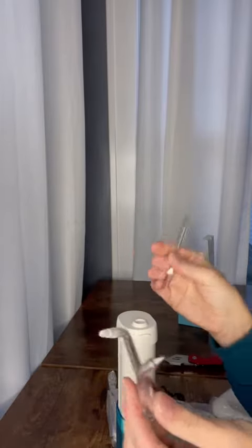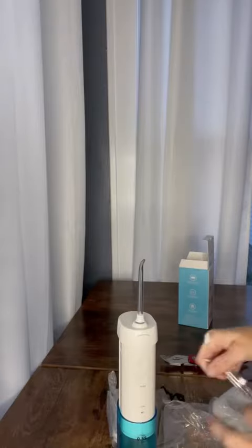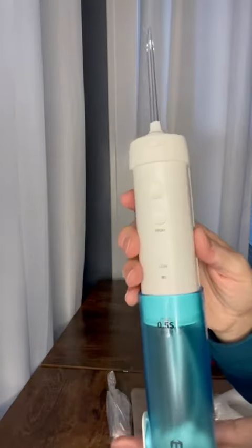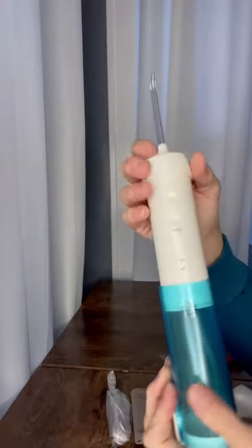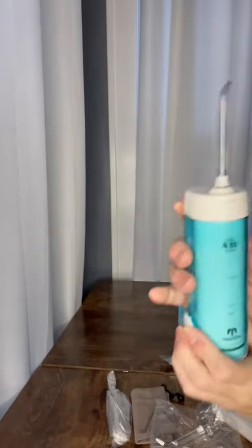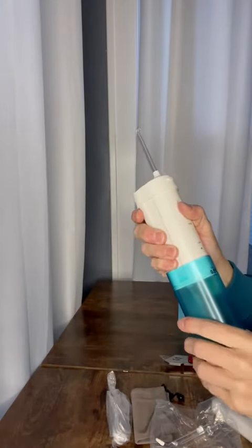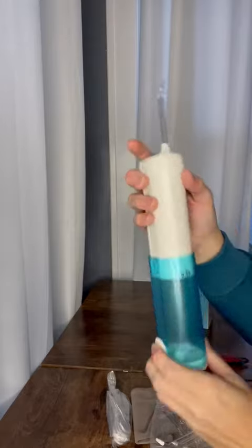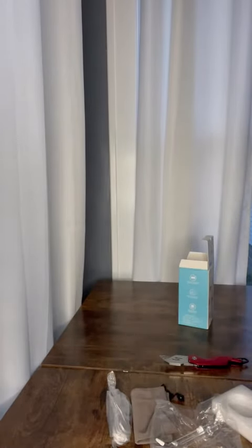Even people without braces can use this — it's an amazing tool to get your mouth clean — but for people with braces it's definitely recommended. I love that it can be so compact; you can just push it down, lock it in place, and store it when you don't have water inside.